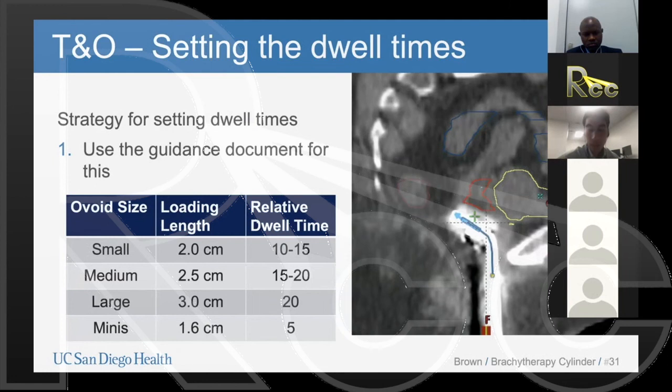So George asks, is it clinically advisable to change ovoid types or sizes or length of tandem in between insertions? And what are its consequences on the total dose after insertion? That is a great question. We will sometimes change the ovoid size or type after the first insertion, if we could see that we potentially had more room and could have used larger ovoids, that would have given us some sort of clinical benefit. And typically, actually, the first insertion is really informative for how we want to do our subsequent insertions. So sometimes if we're really struggling with the rectum dose, we will try as much as possible in the next fraction to set things up to push the rectum out of the field. So there are a bunch of things like that. Maybe we'll think about doing bladder filling if we're struggling with bowel dose.